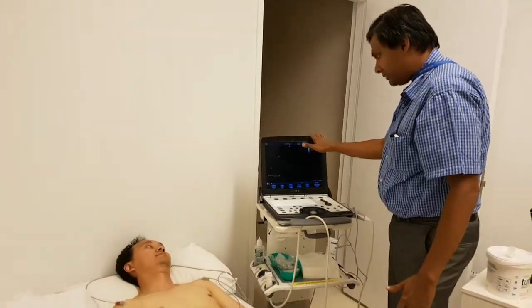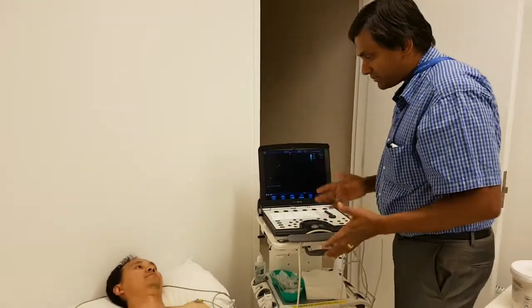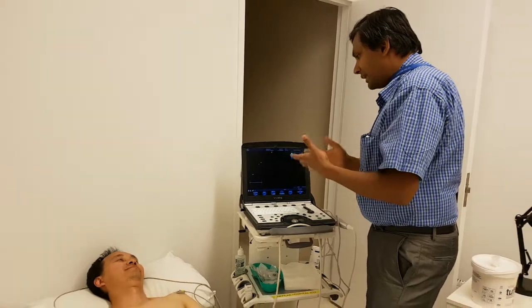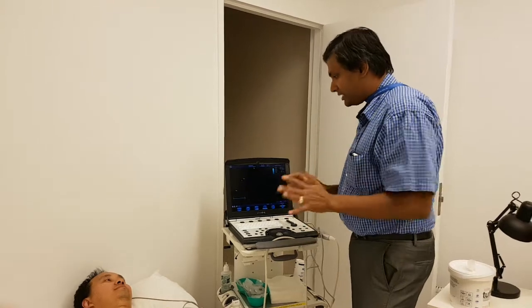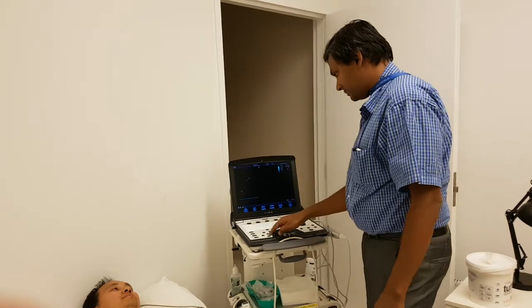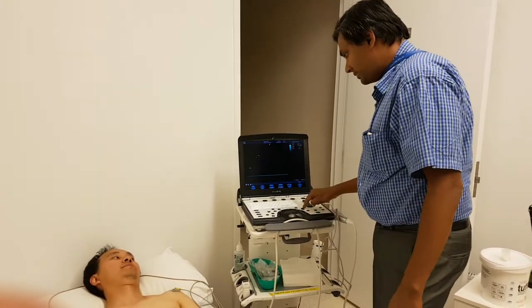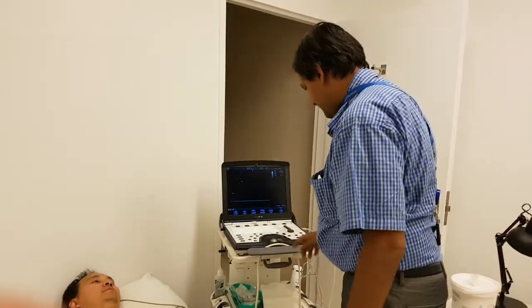This is a GE Vivid Q machine. I'm not really going to go into the specifics of the machine because each machine is different. It's like driving a car — whether you have a BMW or a Kia, you need to know where the accelerator and brake are. For each machine, you just need to know where the 2D button is, where the gain is, where the depth is, and where the M-mode button is. You just need to know some basic things.